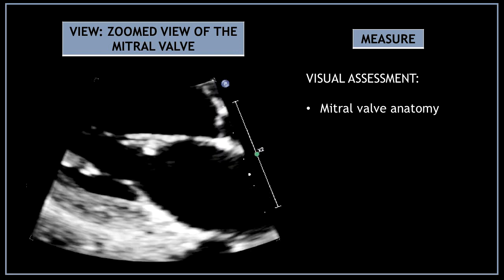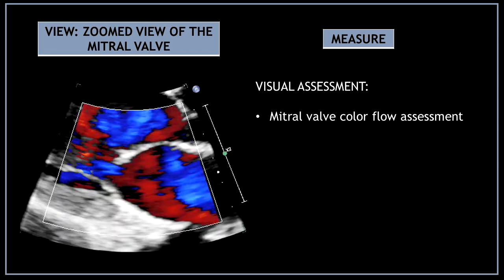Obtain a zoomed view of the mitral valve and do a visual assessment of the mitral valve anatomy. Use color Doppler on the mitral valve to do a mitral valve color flow assessment.